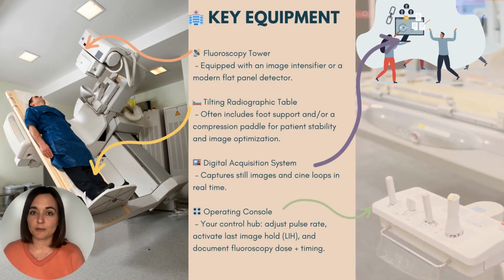Section 2. Equipment and setup. All right, let's talk tech. Before we even touch contrast, positioning, or the patient, we need to set up our battlefield. In GI contrast procedures, we work primarily in a fluoroscopy suite.